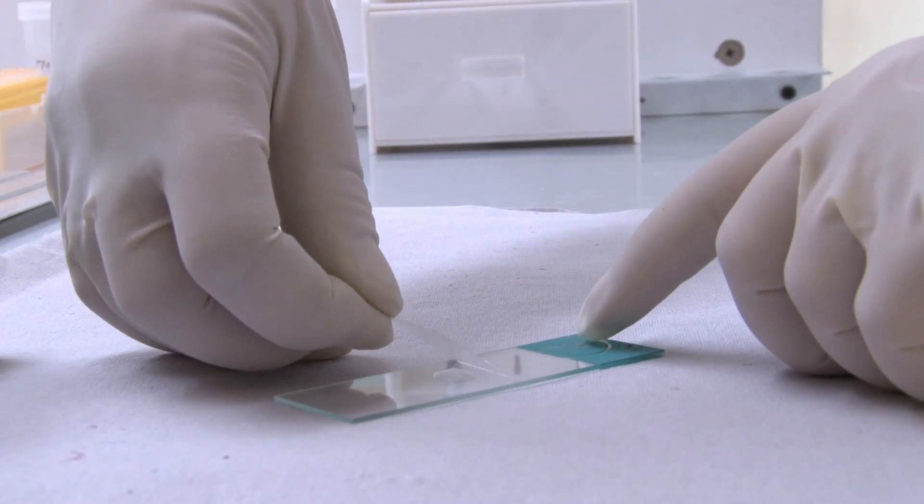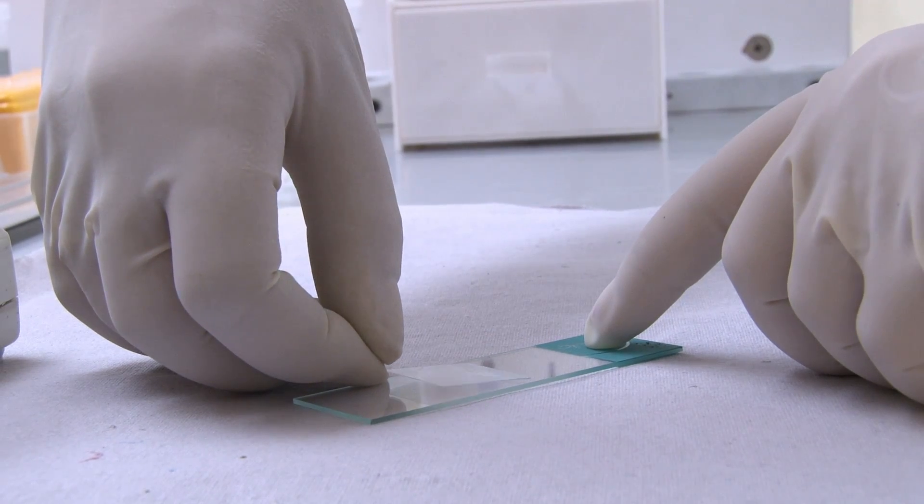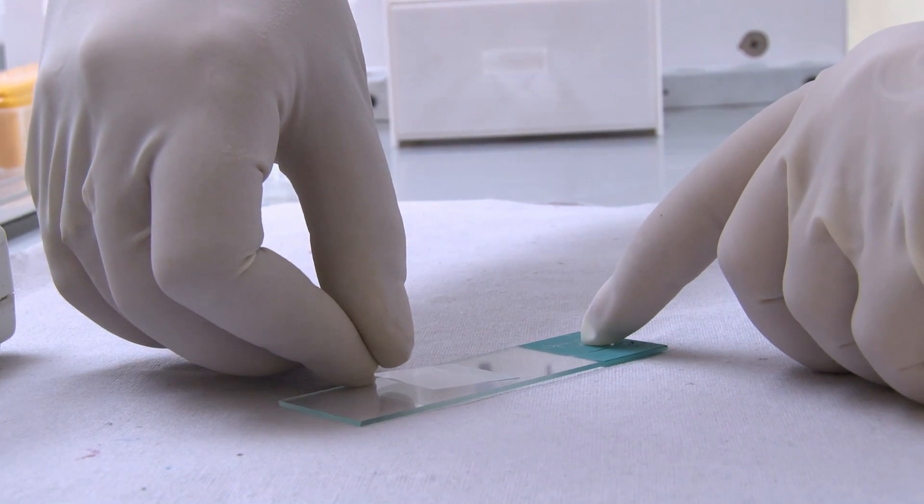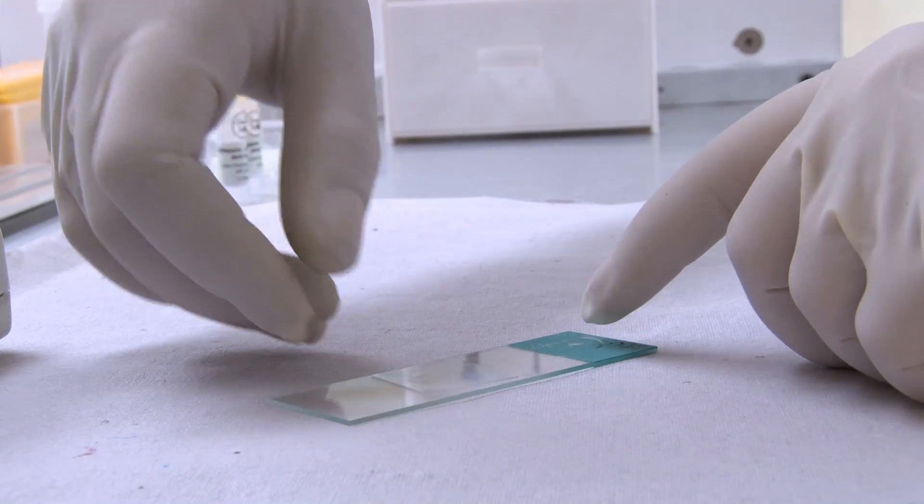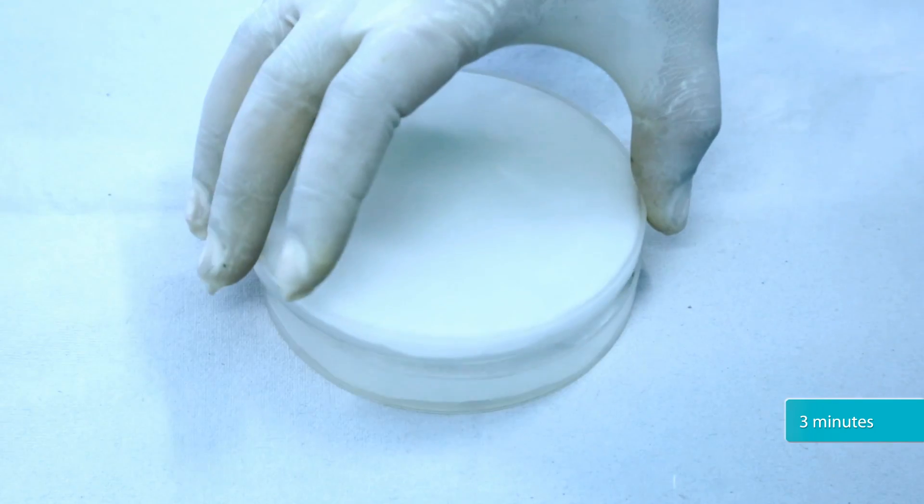Put a cover slip on the slide. Place the slide in the petri dish and incubate for 3 minutes.